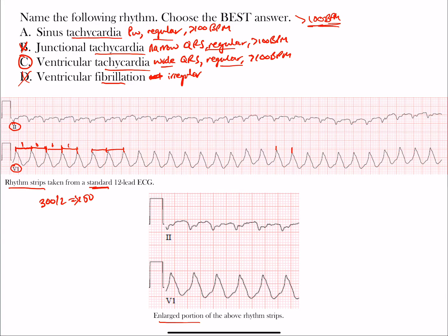Based on this, the best choice is still ventricular tachycardia. Now V-tach is sometimes a very difficult rhythm, even for the most experienced cardiologists, to differentiate from a supraventricular rhythm with aberrancy. Those are very difficult to really differentiate. There's a lot of criteria that's been proposed on how to differentiate between these wide complex tachyarrhythmias - they're all fast, wide, regular rhythms. How do we tell if they're originating from above the ventricles or are they coming from the ventricles, which is more life-threatening, versus an SVT?